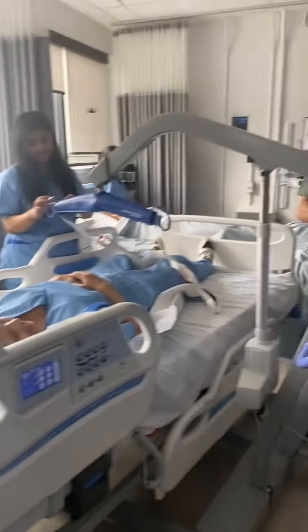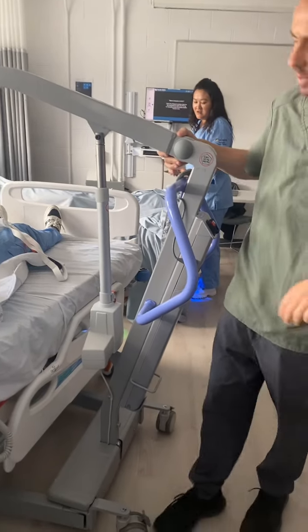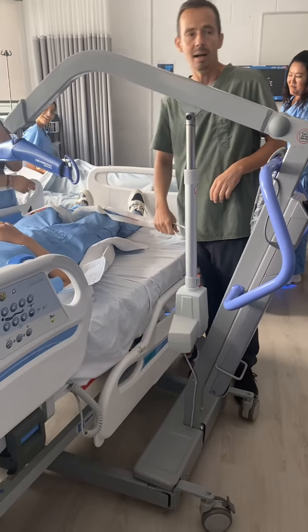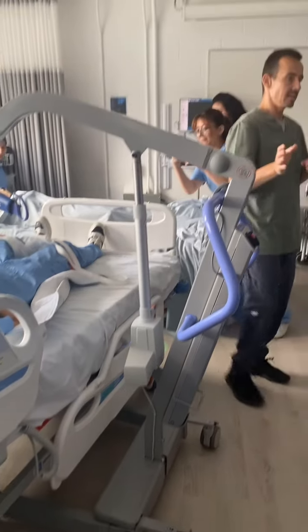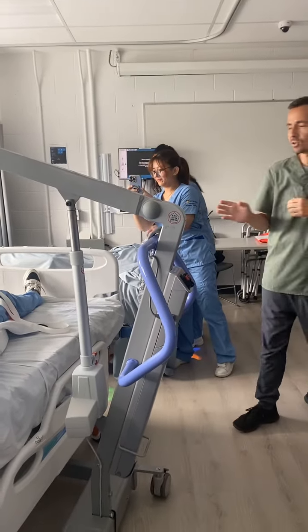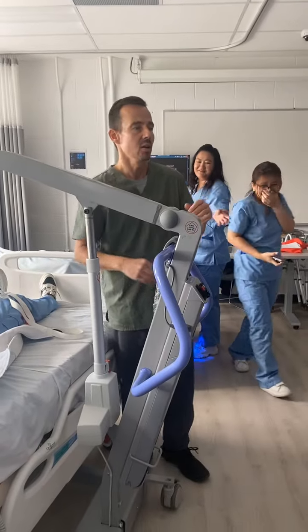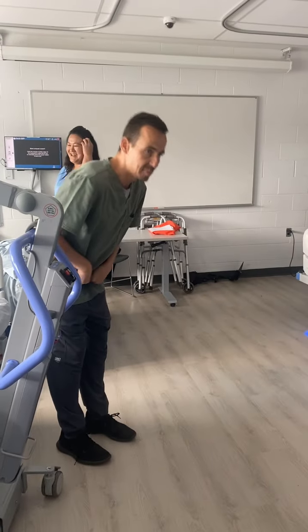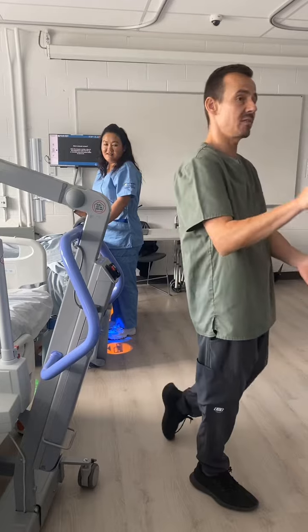So you can do that on your own. You don't need a second person. You put the brakes on before you attach the hooks. Attaching the hooks with most of the slings: when you're going from supine, or lying in the bed, to the chair, you want to make sure that the person is already bent at the hips in the sling to make it easier for you to put them in the chair, especially if you have a chair that doesn't recline.